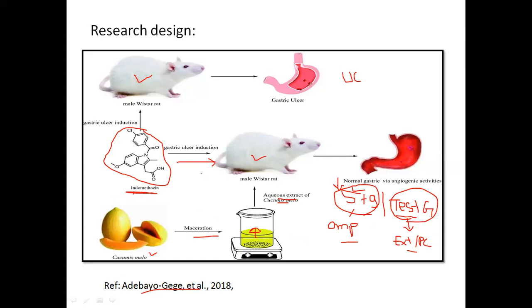I have to induce ulcer by indomethacin and then I have to give the drug. So this drug may be omeprazole or this drug may be any extract. Okay, so one group is ulcerative control and another group may be standard group or test group.